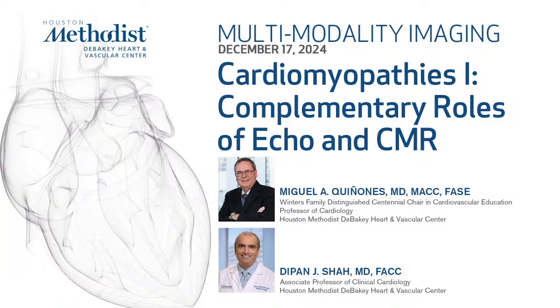Okay, so I've got 15 minutes here. I'm going to tell you guys everything there is to know about cardiac MRI and cardiomyopathies. So if you just imagine you're seeing the ACC appropriate use criteria sitting up there on the screen, you see lots of appropriate indications for cardiac MRI. And really, though, recognize it's not your first-line imaging test, but it's an imaging test that you do.